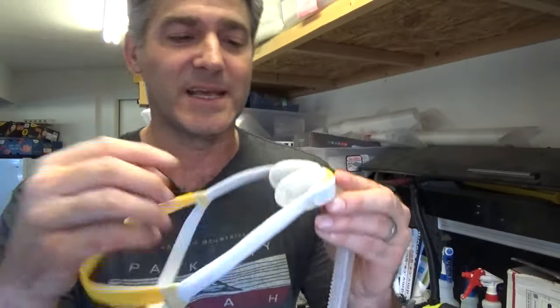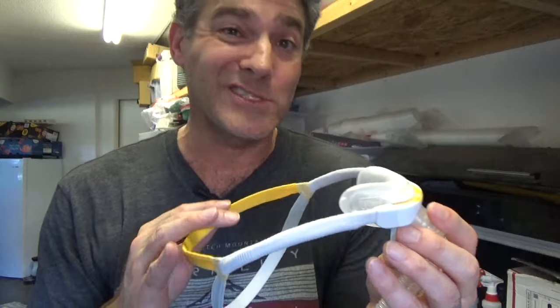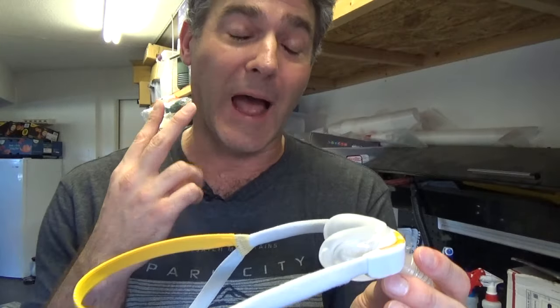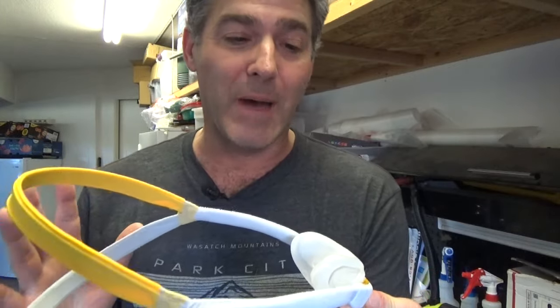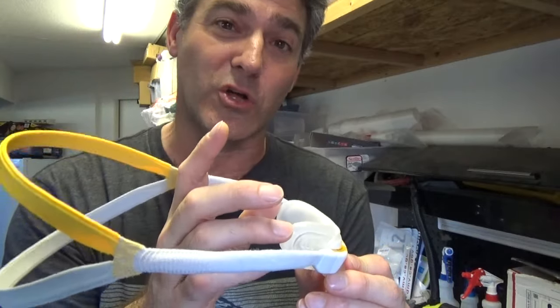The last thing I want to say is that this cushion has another version coming out. It's not out yet, but there's actually a nasal pillow version — like a prong, very much like the Brevita. I am super excited to try that version. The Brevita is one of my top two favorite masks, probably my second favorite. It's going to couple this headgear with a Brevita-style cushion — that's going to be awesome.